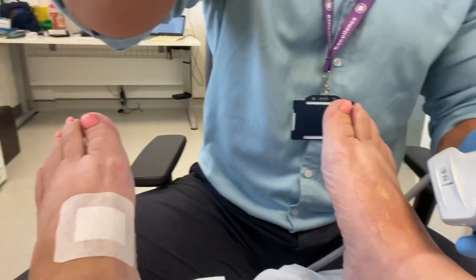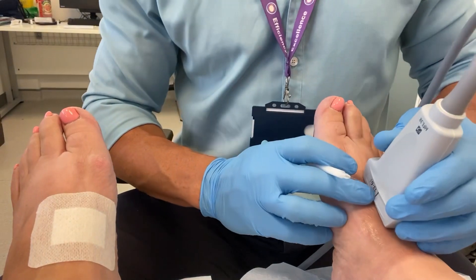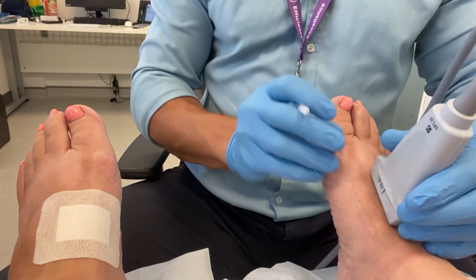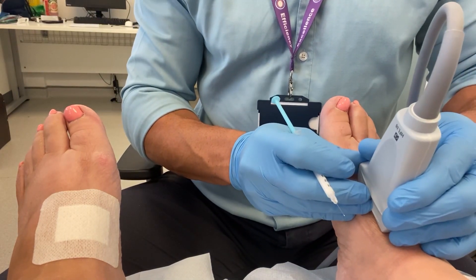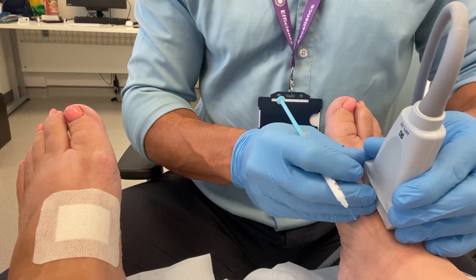This is a most pain-free procedure when using a 29-gauge insulin needle. I'm using one milliliter of fluid, which contains 40mg of depomedrone and 10mg of lidocaine.